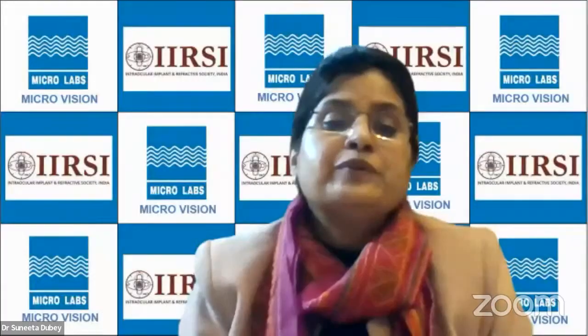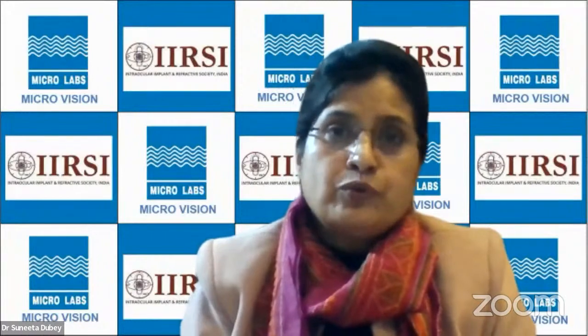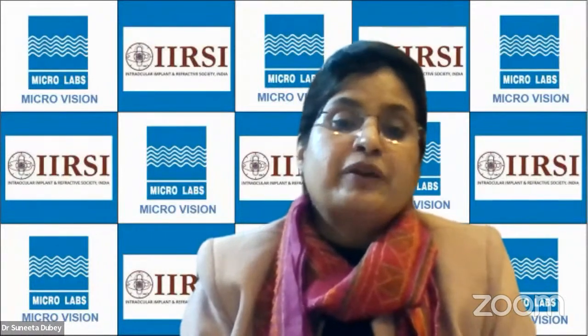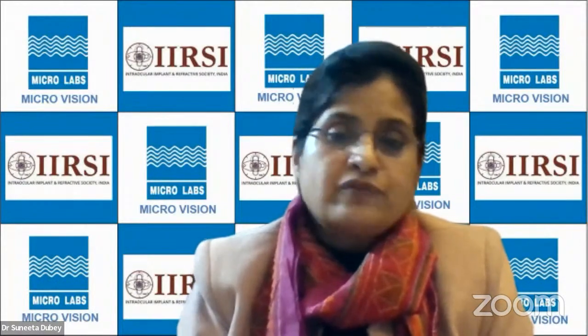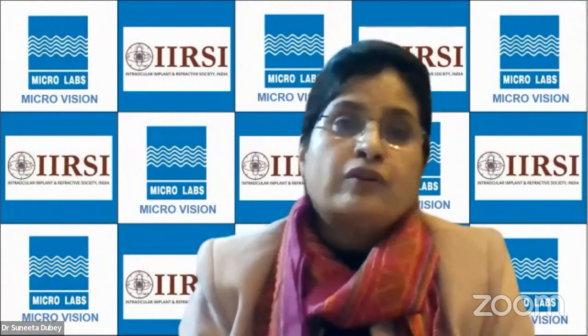And so I have a comment to make. Yeah. If the first surgery has worked for a few years and then it has failed, then there are chances that the second trabeculectomy may work. But if the surgery has failed immediately, because of exuberant scarring, then there are chances that the surgery may not work. So, Dr. Vinod, I think a retrab is less likely to work than the primary trab.